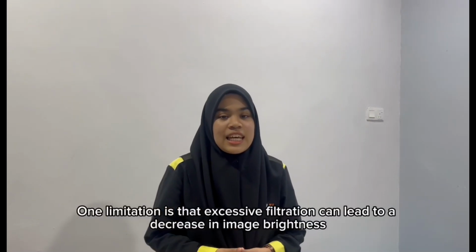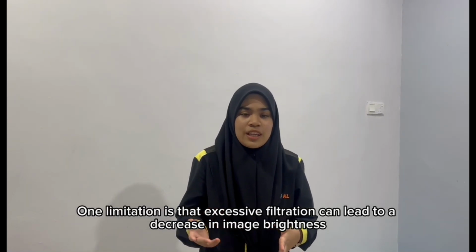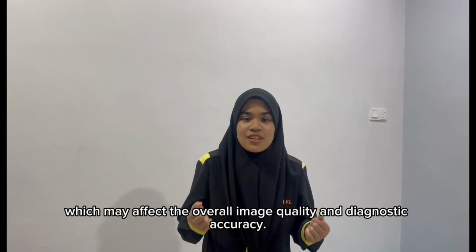One limitation is that excessive filtration can lead to a decrease in image brightness, which may affect the overall image quality and diagnostic accuracy. Okay, that's all from me.